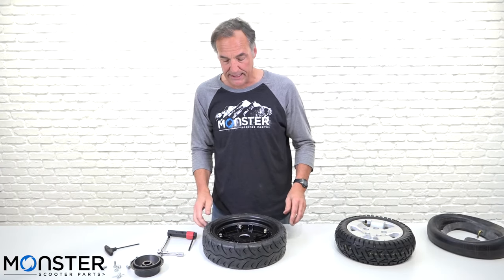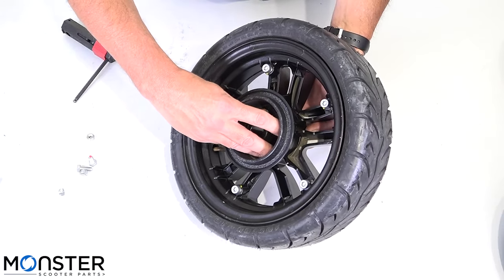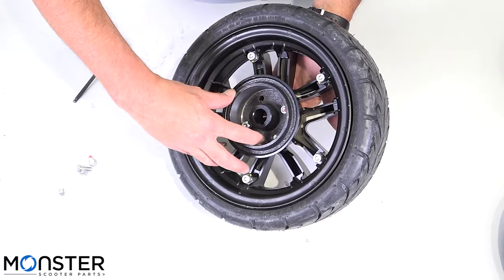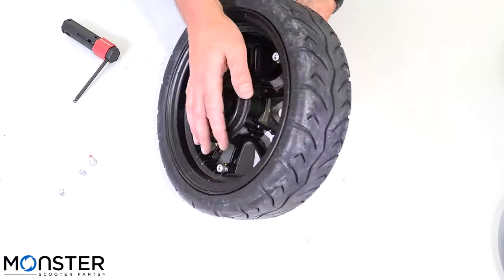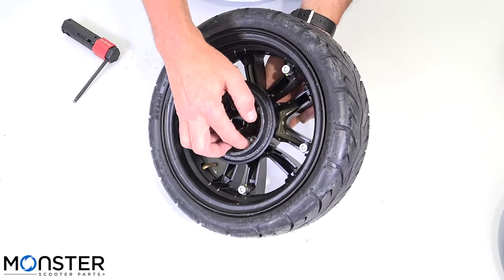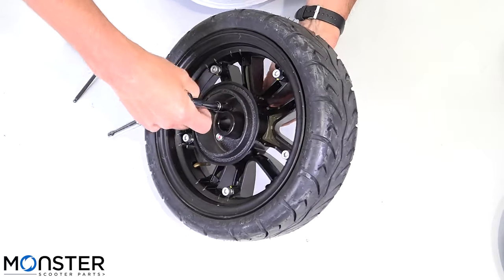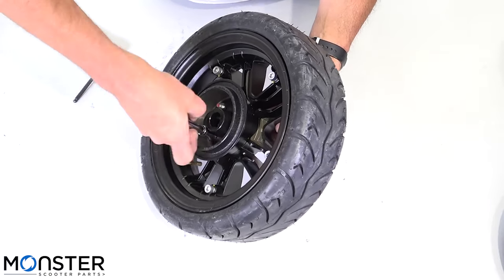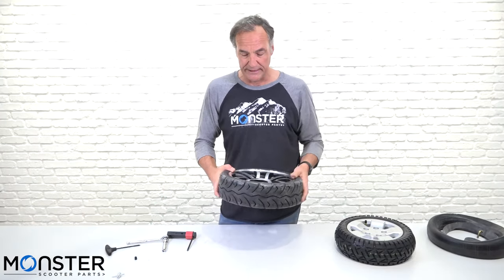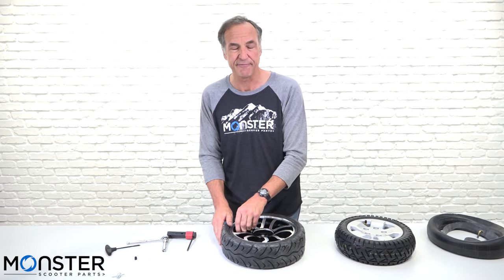Now we have our rim back together. Next you want to put the hub back on. When you reassemble, go opposite sides when tightening these down, just like on a wheel. And there you have it — your wheel is reassembled with the tube in it. Next you want to fill it up with air, usually 35 to 40 pounds on most scooter tires. Now that we're all done with the Drive Cobra GT4 wheel, we'll move on to the Pride Victory and Pride Pursuit XL wheel.